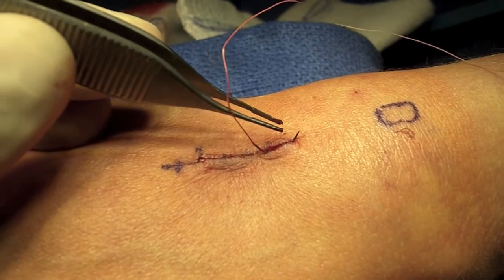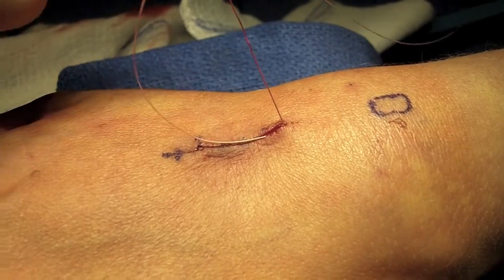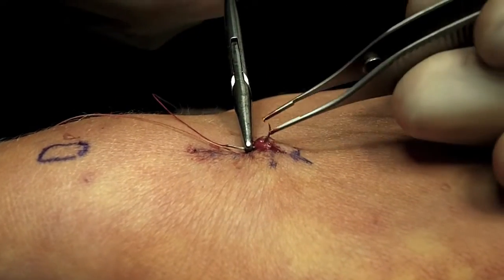Next, I anchor one end of the suture in one corner of the wound and tie a knot. This buries the first knot. I then pass the needle and suture in and out of the dermis layer of the skin and eventually out the opposite end of the incision.